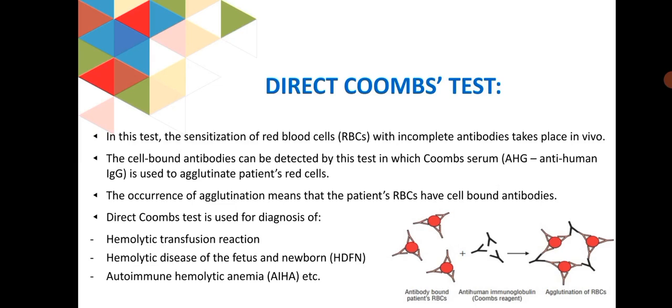Direct Coombs test is used for diagnosis of hemolytic transfusion reaction, hemolytic disease of the fetus and newborn, autoimmune hemolytic anemia, etc.